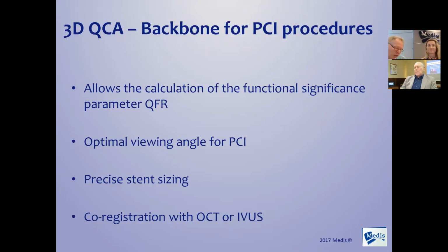So with this as a technical background, I will just give the word to Dr. Di Girolamo to give his presentation about the use of the software in a clinical setting. Thank you, Gerhard.